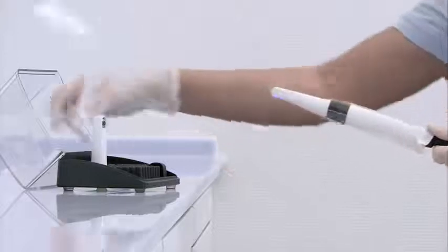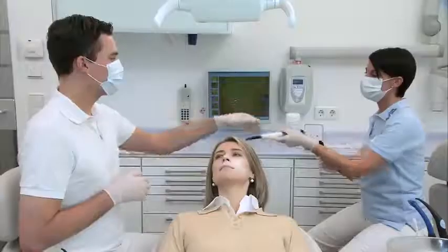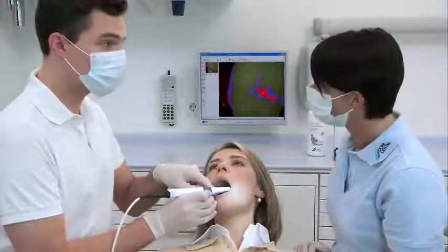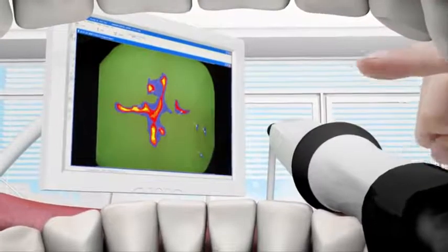The key to maintaining healthy teeth for a long time is detecting tooth decay early on. The proof interchangeable head makes caries and plaque visible to the practitioner. Metabolic products of cariogenic bacteria are stimulated by the violet light of the LEDs and show up red, which is particularly helpful for areas that are difficult to reach.